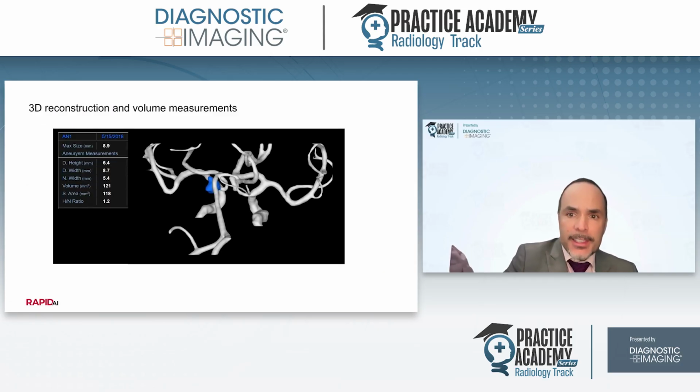Now, I also want to stress that not only does it give you that kind of 3D localization and those standard measurements across that mesh, but this has also enabled an entirely new array of measurements beyond the standard 2 or 3 cross-sectional measurements in routine practice, including a lot of volumetric and more advanced geometric representations of an aneurysm and its morphology, the presence of dysmorphia, the presence of non-sphericity, findings that are more and more emerging as potentially more interesting or more predictive, or at least compelling for study, than we can really produce in clinical real time.